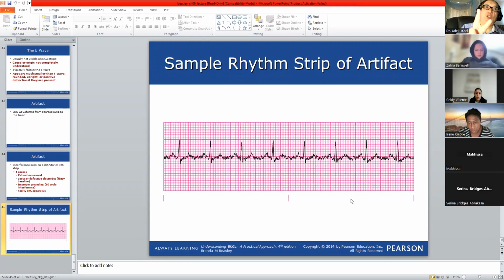We mentioned that we have positive and negative and ground. You remember the outlet has 3 holes: positive, negative, and the third one is ground. Why do we have ground? For safety, to absorb any extra voltage or extra charge coming from electricity, so we are not going to have shock. All the machines attached to the patient have this ground, and this ground helps us to be in a safe technique. You got it?